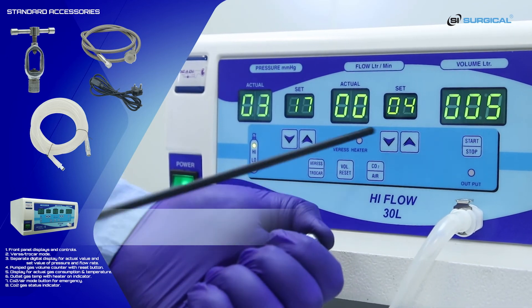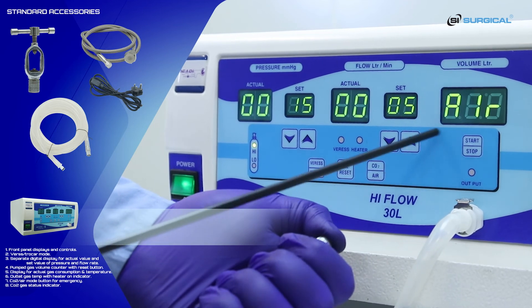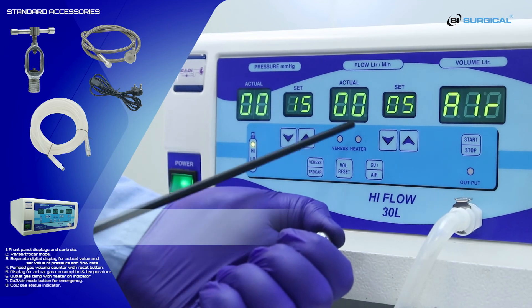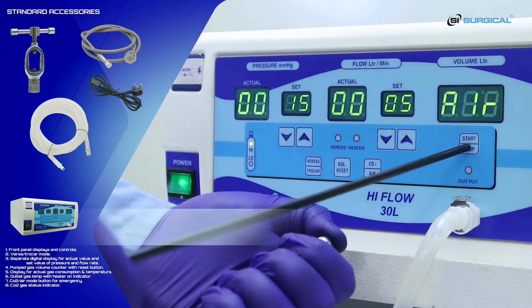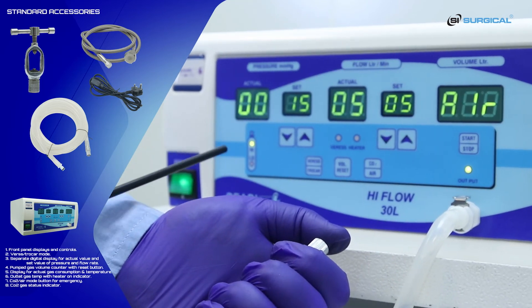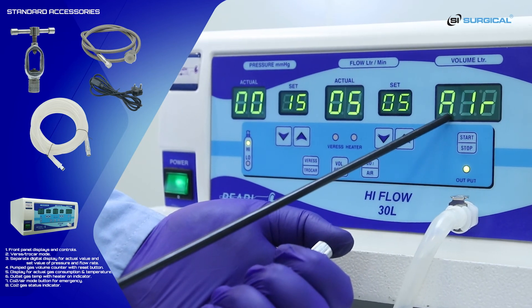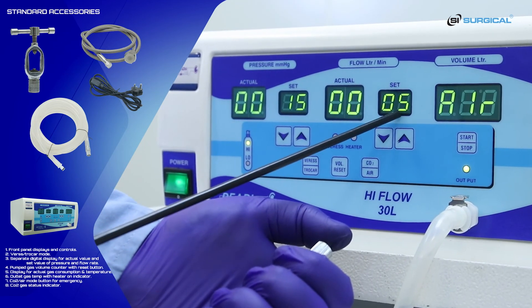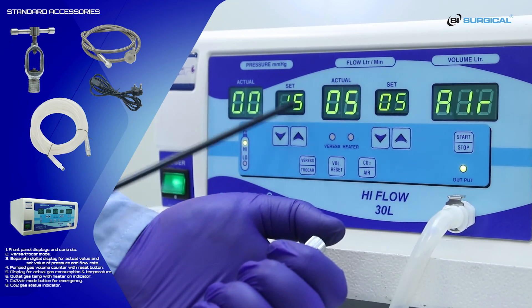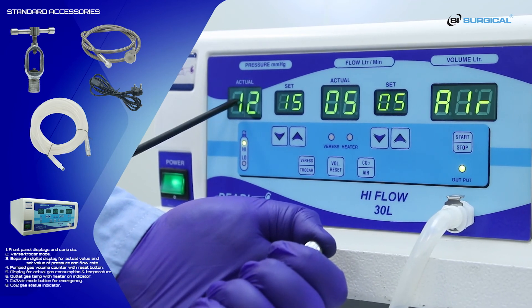If we activate the air mode and start, the machine sounds like this. When the actual pressure and set pressure are the same, the air supply is completely stopped.